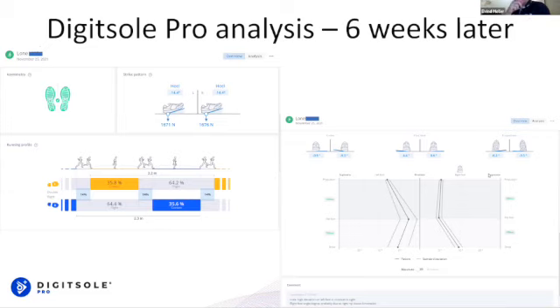What we see is that she still keeps the strike angles when we look into the left and right side, still attacking with 0 degrees on the left side and keeping 10 degrees on the right side, again probably due to the hip issues that we were talking about in general. And as such, we observe it and we assess it, but we should take it into consideration, while trying to reach a specific number of degrees here is not the outtake.